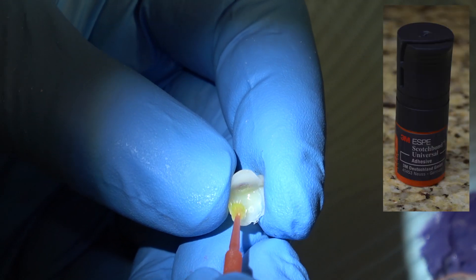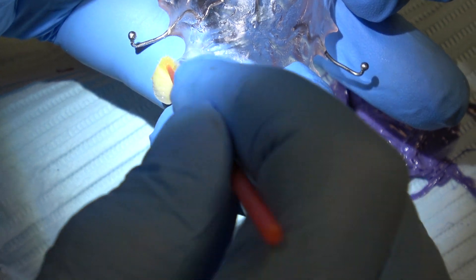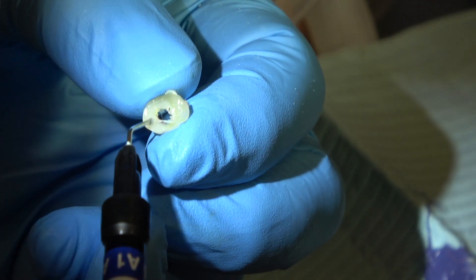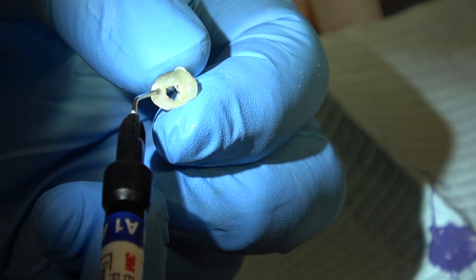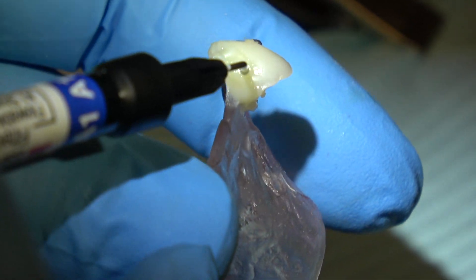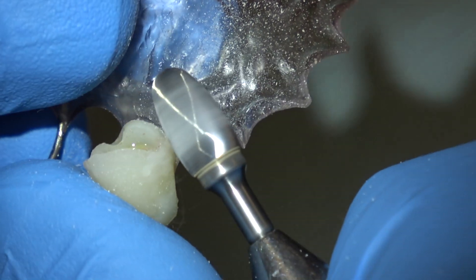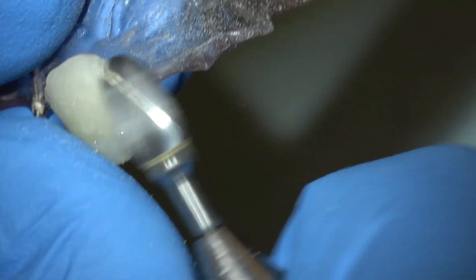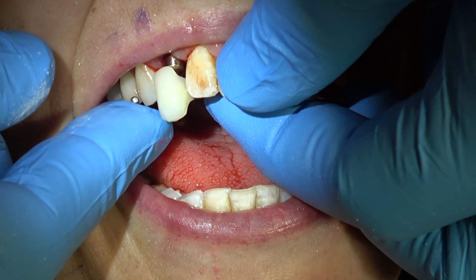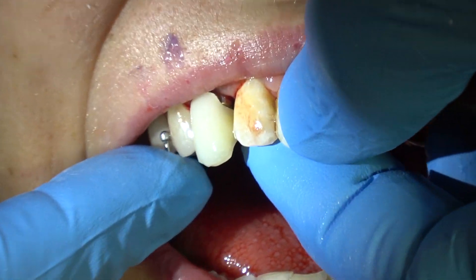I'm luting that part to the flipper. This is flowable composite — I'm just sculpting that to make it look like a tooth. This can be done rather quickly; it probably takes 15 minutes to seat this flipper. It's very important that the underside doesn't contact the healing abutment.